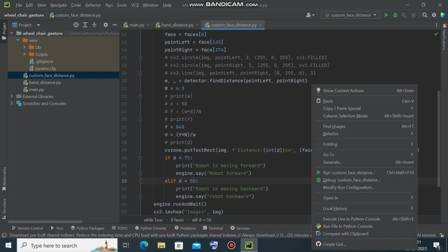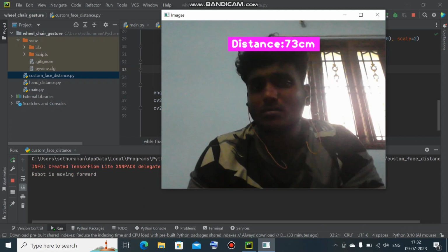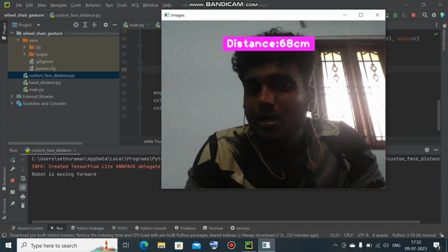robot is moving forward, and will say as a voice message, robot forward. And when my distance from the camera is lesser than 50, it will print robot is moving backward, and it will say as a voice command, robot backward. Let us check now. So in between 75 and 50, it won't say anything. It will be neutral. It is running. Yes, you can check now. My distance is currently 65. So as I said previously, if my distance is between 50 and 75, it won't say anything.